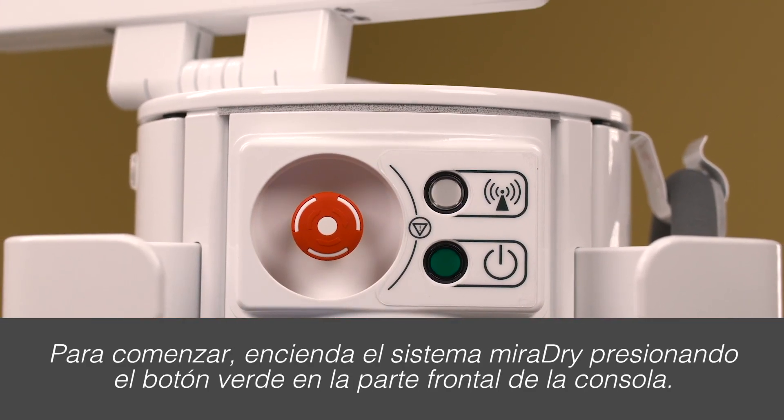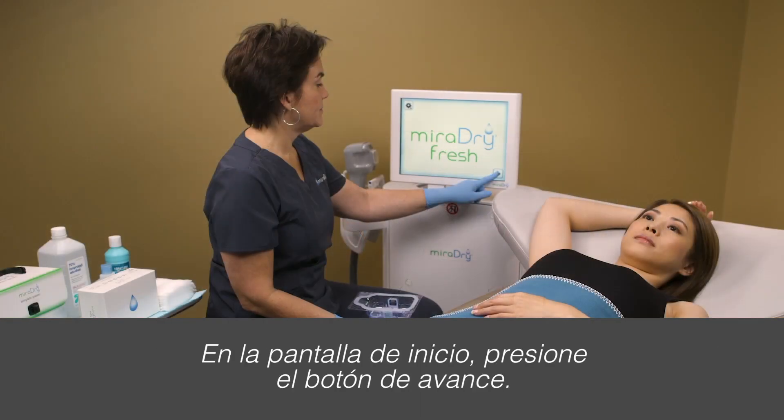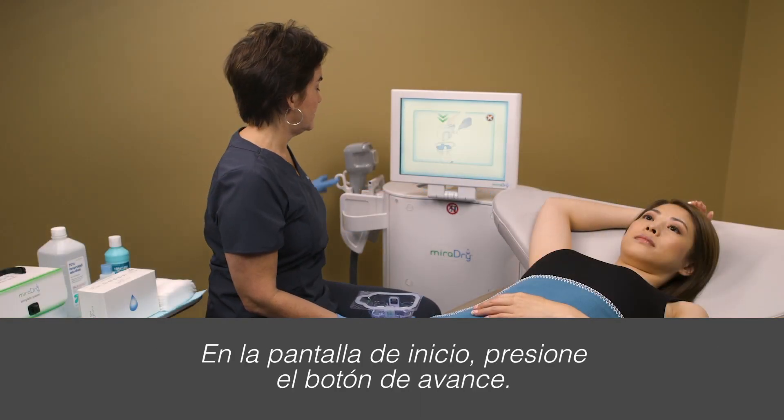To start, turn on the Miradry system by pushing the green button on the front of the console. On the home screen, push the forward button.